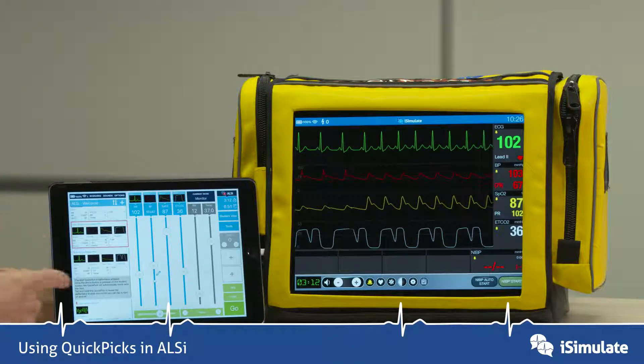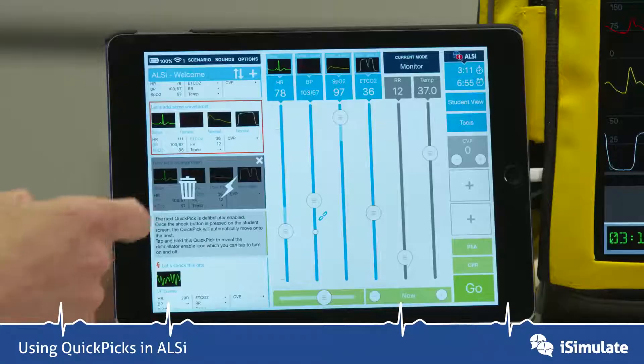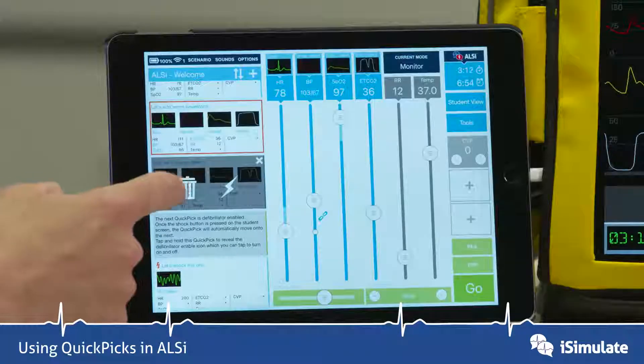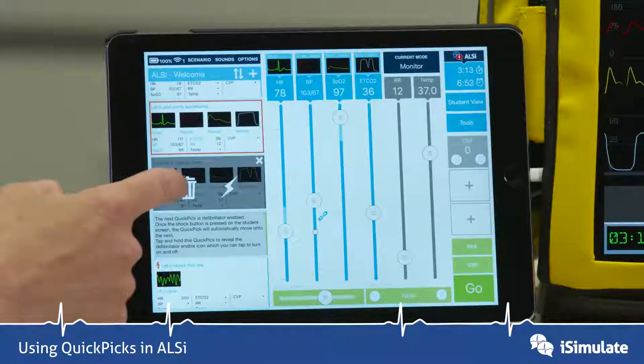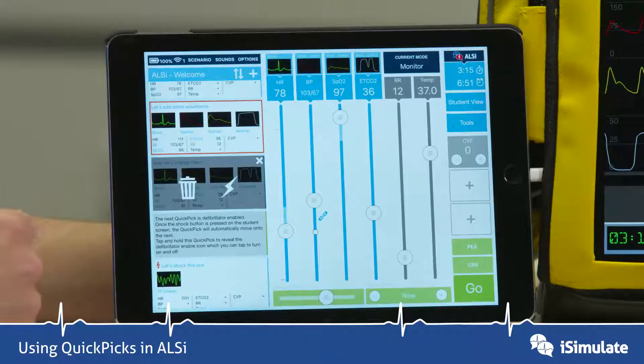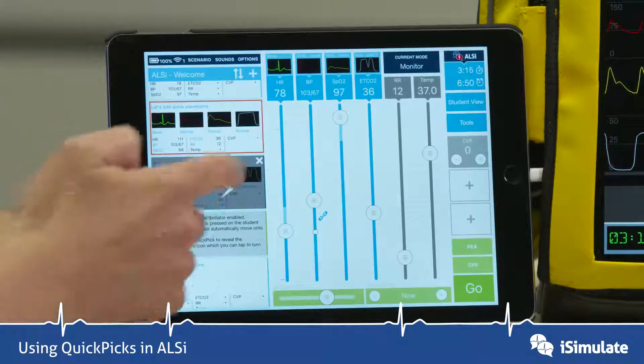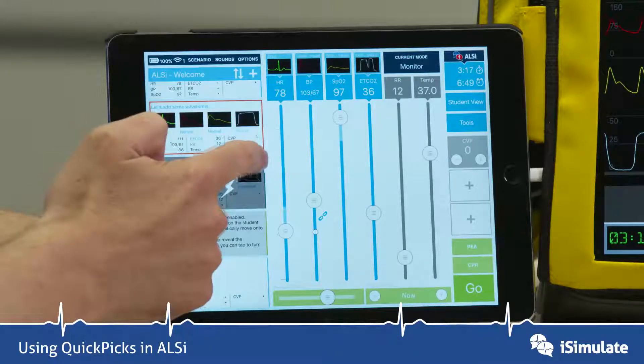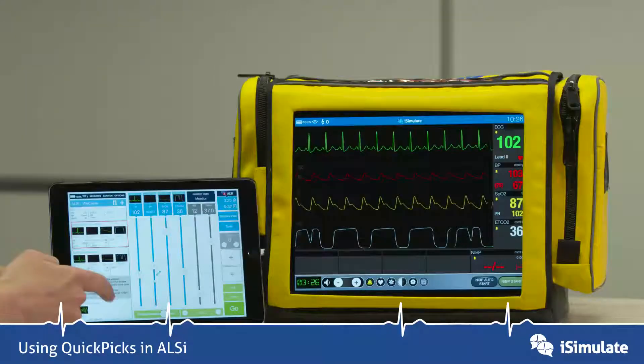You may have noticed that when you tap and hold, there's a bin icon to actually delete the QuickPix and a little lightning bolt icon. Let's show you what that means with the next one.